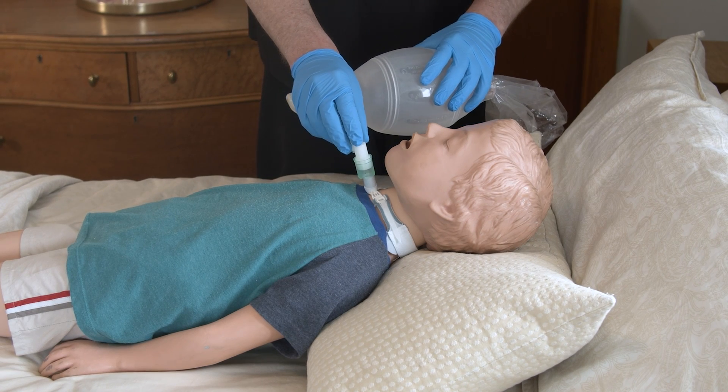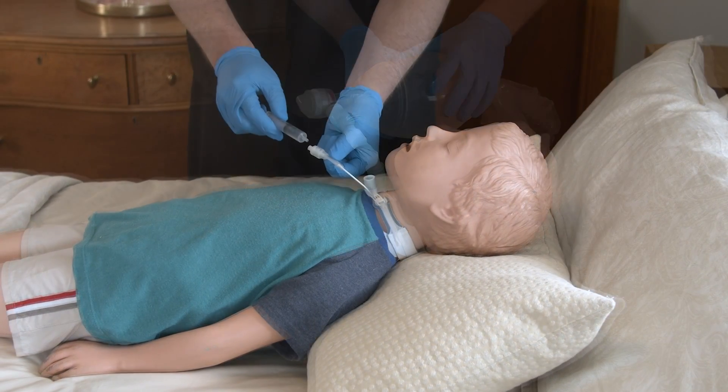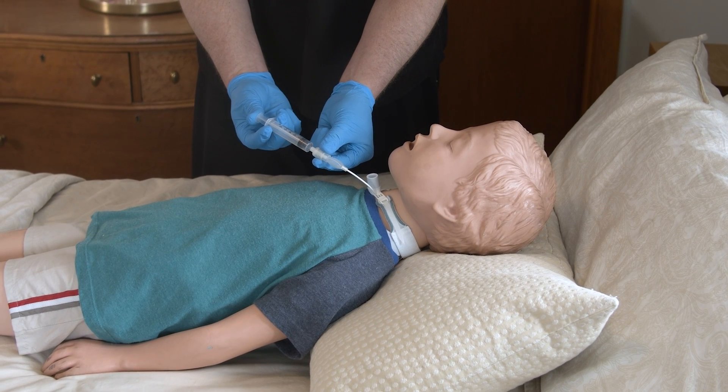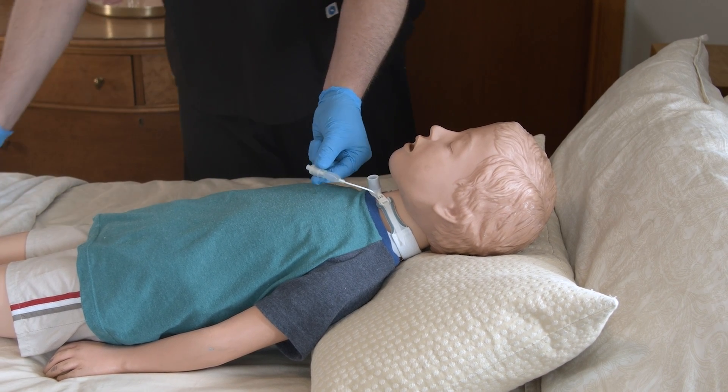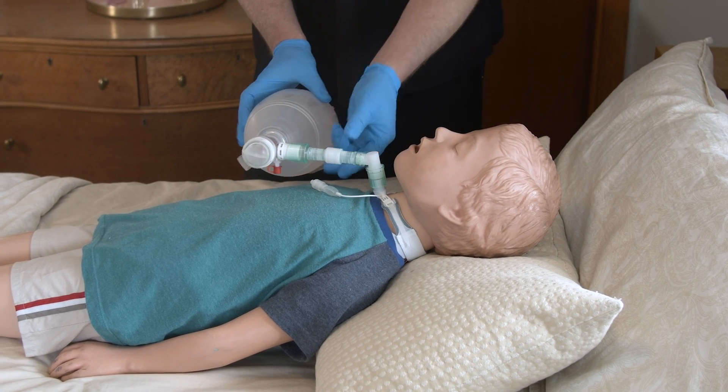If your child has a trach tube, attach the adapter to the trach tube. If it's a cuffed trach tube, check the child's care plan. Typically, breath stacking requires that the cuff be inflated to maintain pressure in the airway.